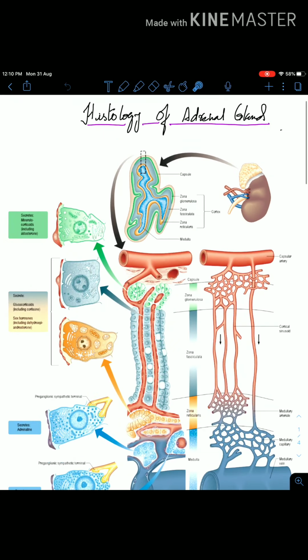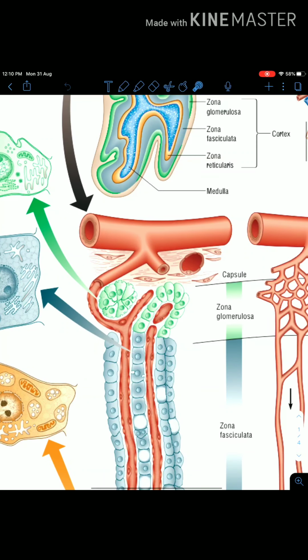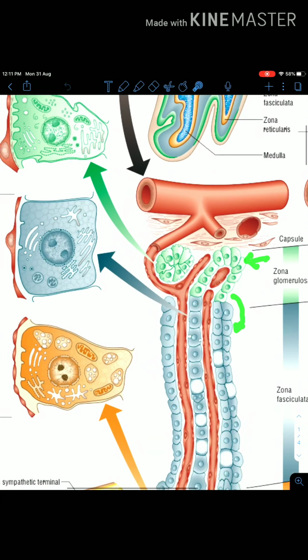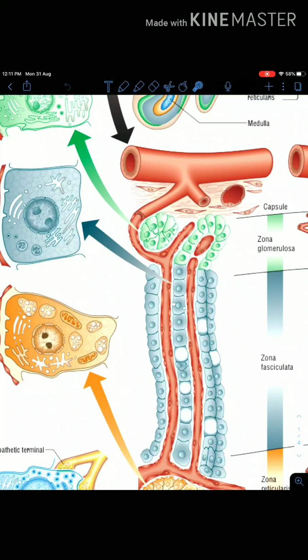The cells that are present within this zone are relatively small and columnar or pyramidal. These cells are arranged in ovoid clusters or curved columns that are continuous with the cellular cords of the zona fasciculata. The cords or the ovoid clusters have a rich sinusoidal capillary network present between them, so that the cells can pour their secretions directly into the bloodstream, and the bloodstream can carry these secretions away from the gland to their target organs. That is basically how an endocrine gland functions.